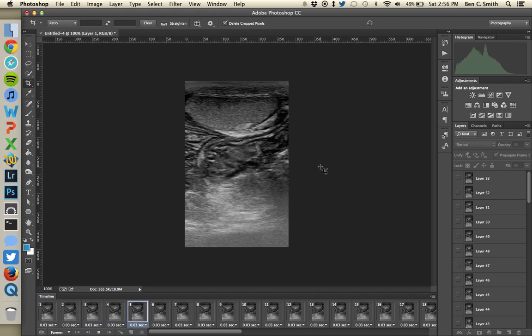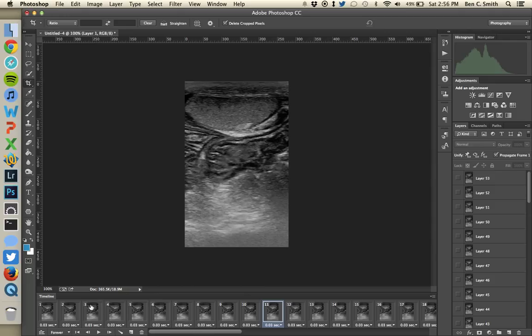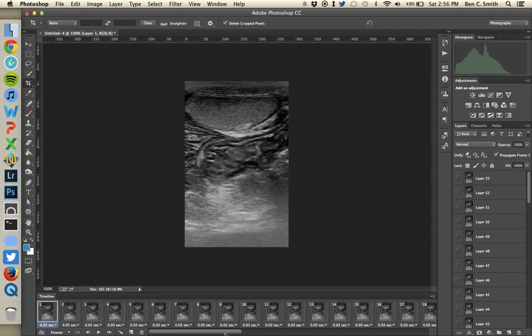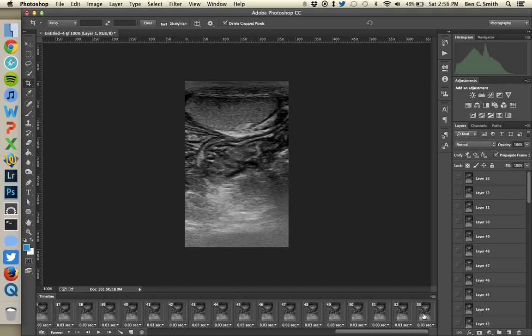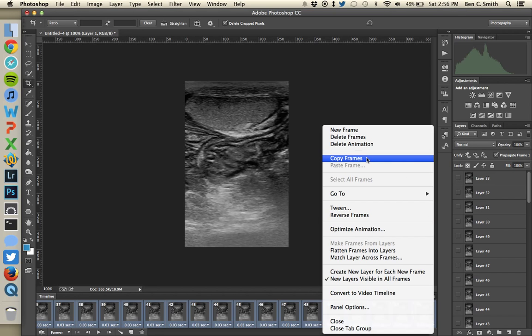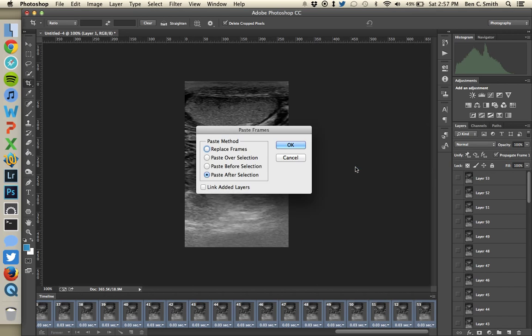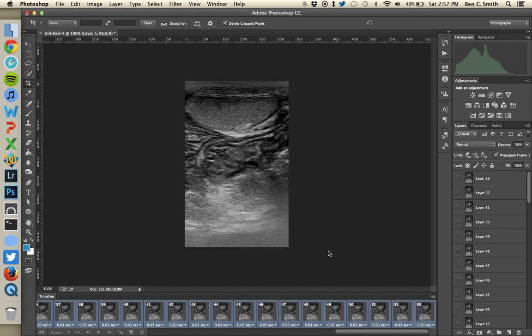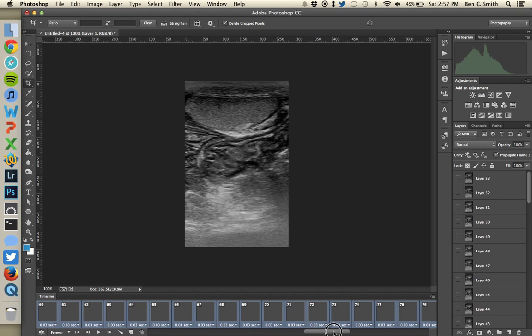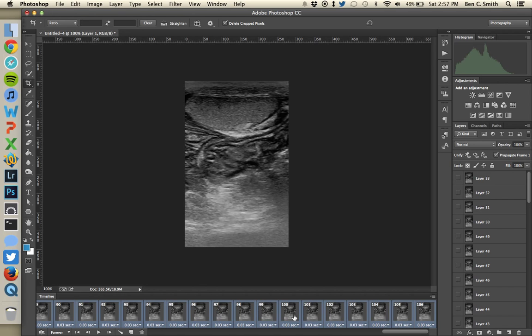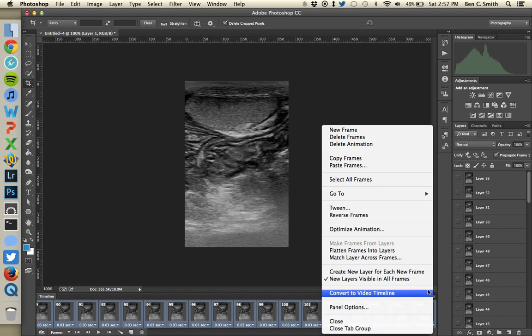To eliminate the jump, select all frames — click the first frame, then shift-click the last frame. From the fly-out menu, choose Copy Frames. Then open the fly-out menu again and choose Paste Frames. Make sure 'Paste After Selection' is selected, then click OK. Now you have the same frames duplicated at the end. With those end frames still selected, open the fly-out menu one last time and choose Reverse Frames.